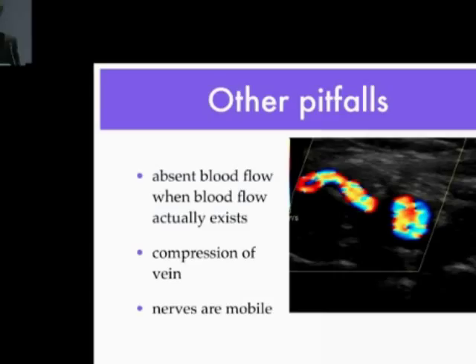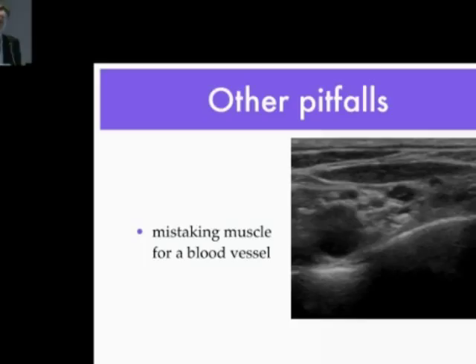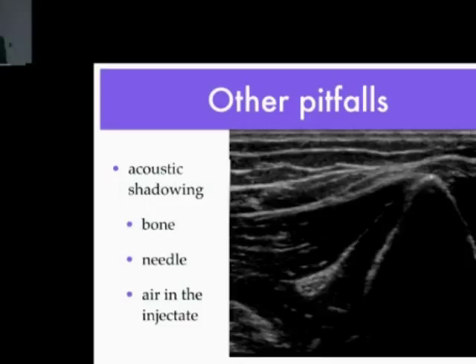Another pitfall is mistaking a muscle for a blood vessel. Just above the clavicle, a long tubular hypoechoic structure could be mistaken for a blood vessel, but it is the omohyoid muscle. Bone does not transmit ultrasound — it reflects ultrasound — so when scanning near bone, there is a lot of dropout. We must use that dropout as part of a map to orientate ourselves. There is an excellent article by Brian Seitz, 'Artifacts and Pitfall Errors Associated with Ultrasound-Guided Regional Anesthesia,' published in Regional Anesthesia and Pain Medicine — core knowledge for all practitioners.